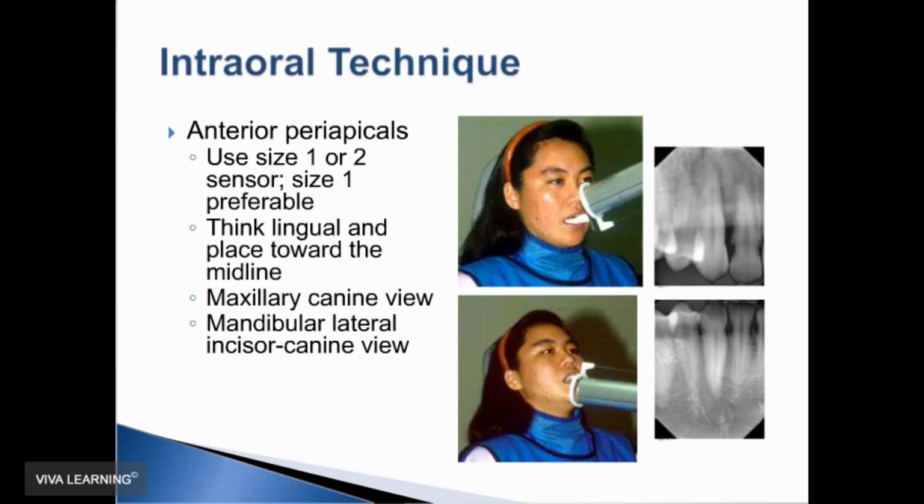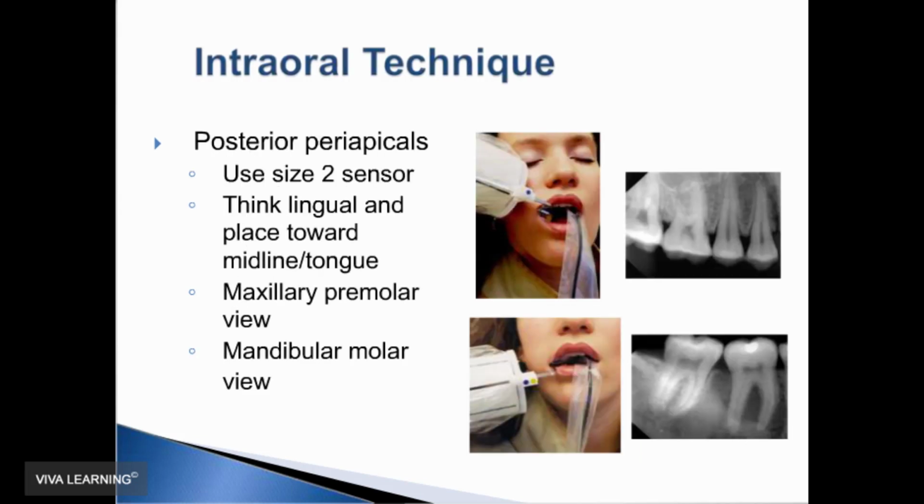You notice on these periapicals, you'll see overlapping in the premolar proximal area. We are not expecting to see proximal in the premolar area, but between the lateral canine contact. For the premolar and molar periapicals, it's best to place the receptor as close to the midline as possible.